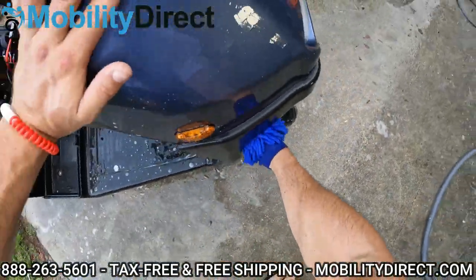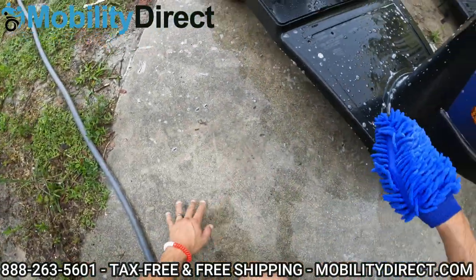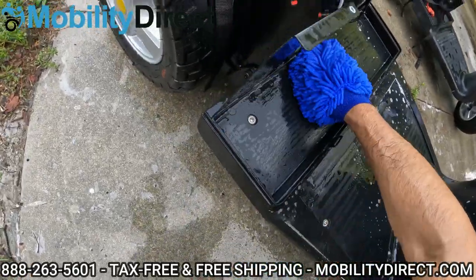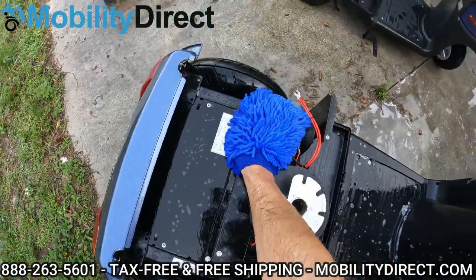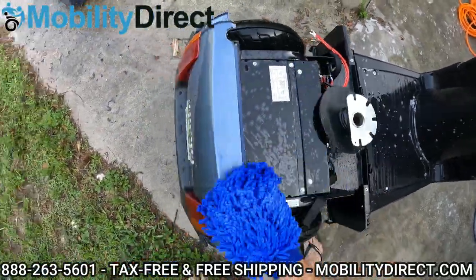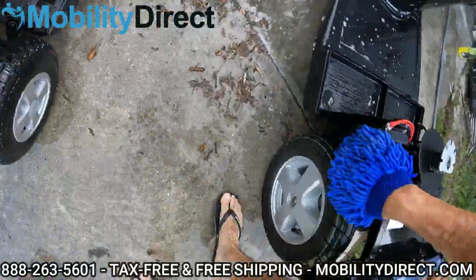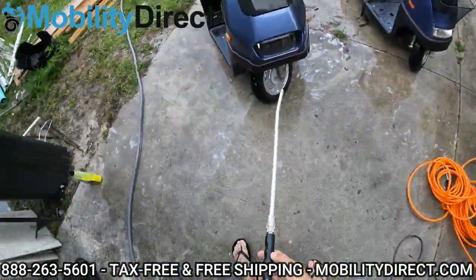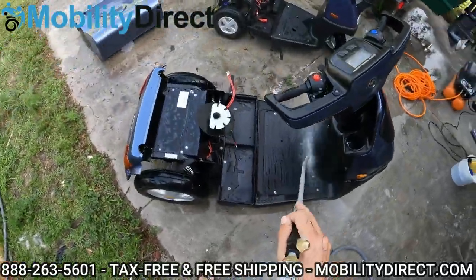I'm getting underneath the wheel well here where a lot of mud tends to accumulate as you're driving and the wheels are kicking up. Get underneath the frame because dirt definitely gets kicked up there too — getting everywhere, all the panels, all the surfaces. We want to make this thing shine and be proud of it. So the first scooter has been washed with soap. Don't want to let the soap dry and create soap spots. So I'm going to rinse this one down and then move on to the other model.